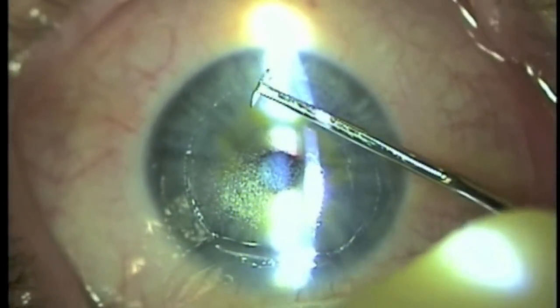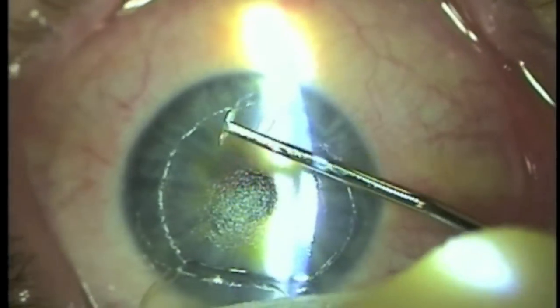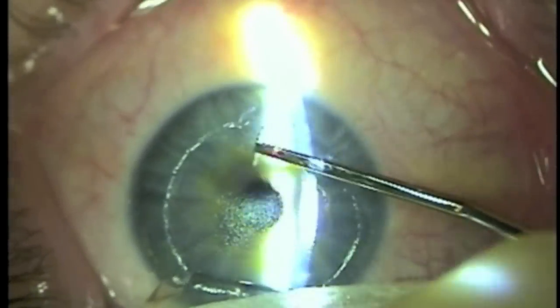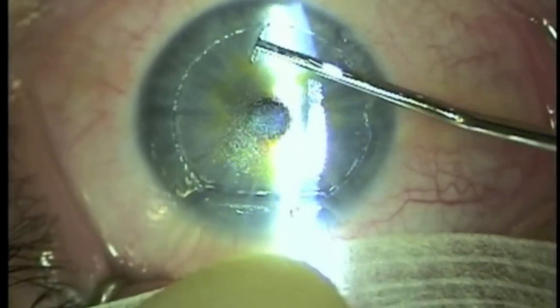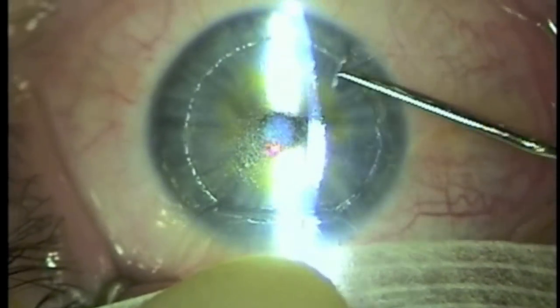This sheet is peeled back with the use of a micro-hoe. These cells are carefully removed from the corneal bed, and care is taken to ensure that the gutter area is clear of cells too.